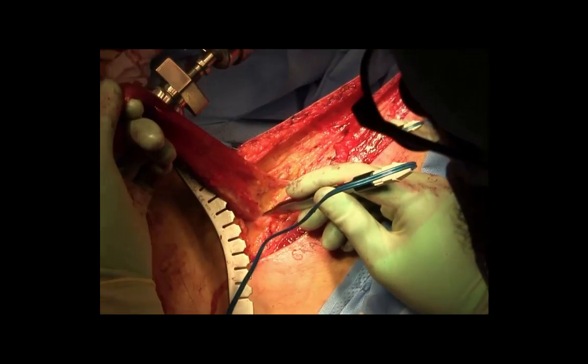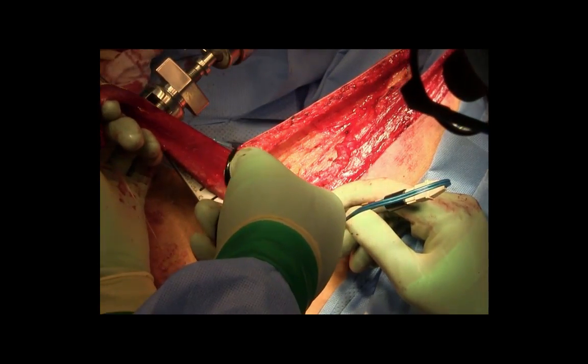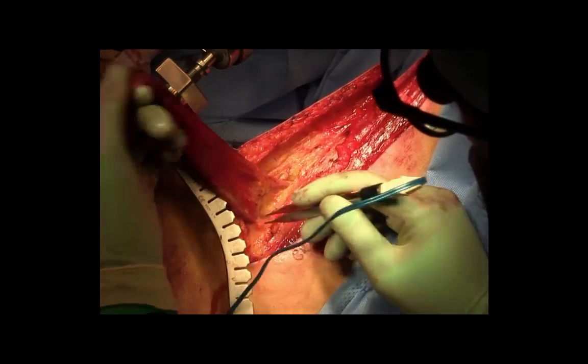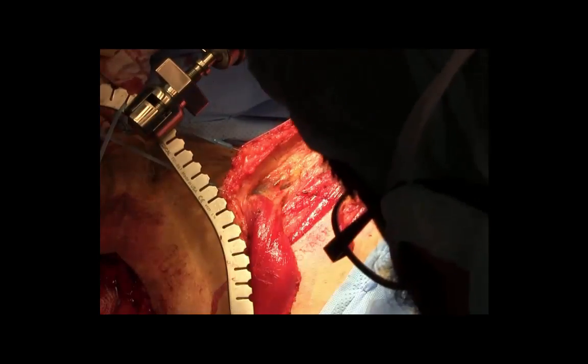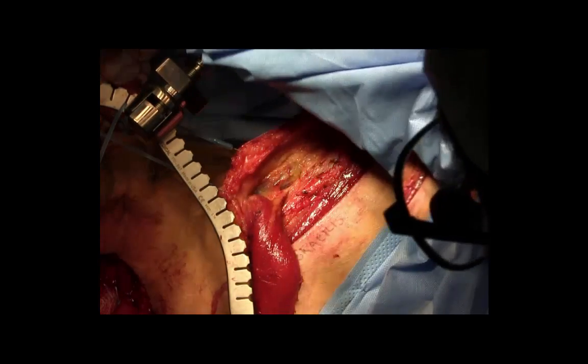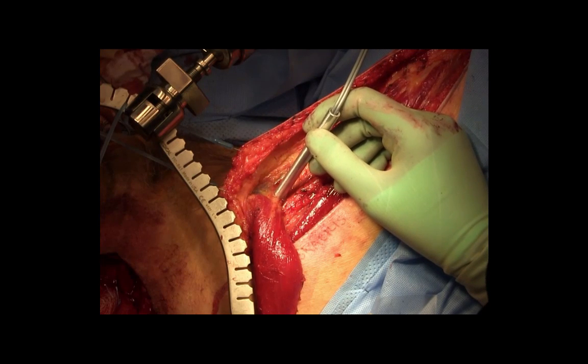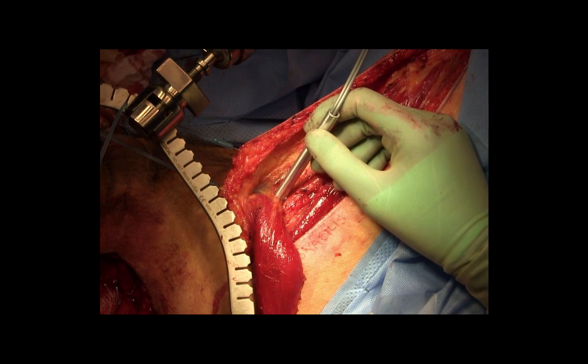Here you can see the vascular pedicle being dissected free using the bipolar-type Adzen forceps. The vascular pedicle has been dissected underneath the adductor longus to reach the greatest length for the gracilis muscle flap in the perineum. Here the Doppler confirms good vascular flow.